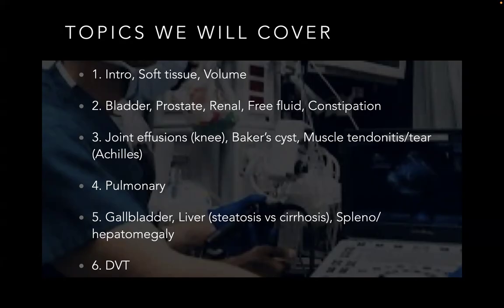We'll start off with high yield scans that are easy to learn and will progressively become harder and harder, and maybe potentially less frequent. But the first few months are going to be the ones where I think there is the highest utility and the highest yield for all primary care clinicians.